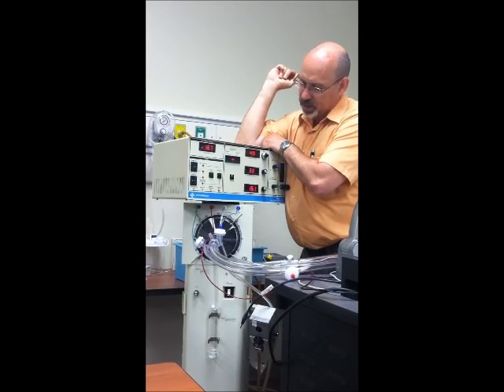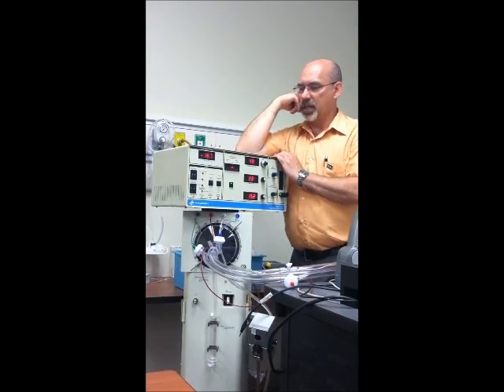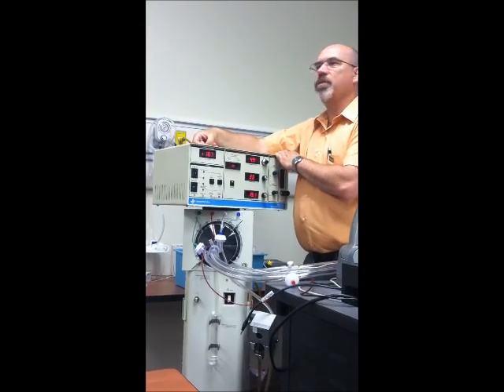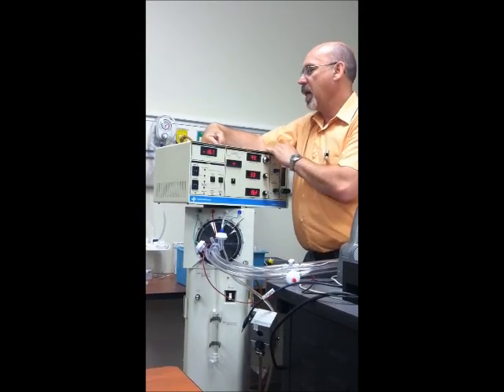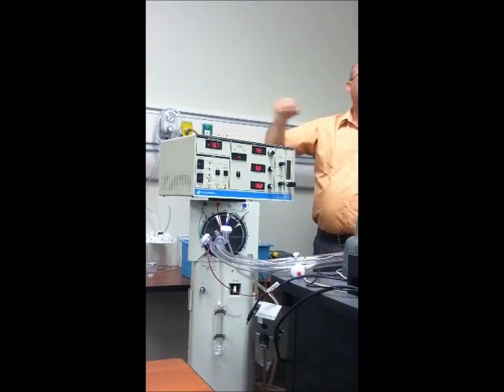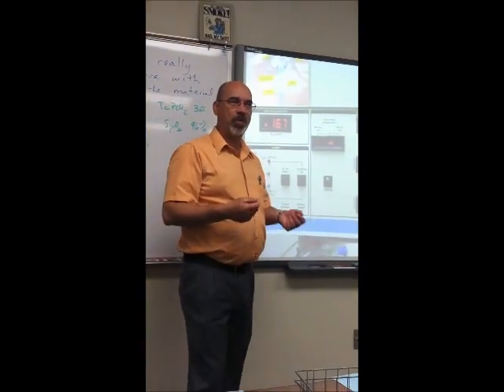I hate to go through, because Carrie just put this circuit on, and make sure all these diaphragms are on good and things like that. So at altitude of 0 to 2,000 feet, which we're at right now, I should have a mean of between 15 and 23, and I actually should have a delta P of about 56 to 75, so I'm a little low on that. So there may be a little bit of an issue with the circuit. This is not one where, because of the expense of the circuits, we're going to take it apart and put it back together.